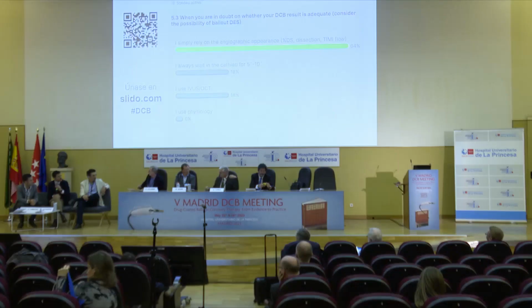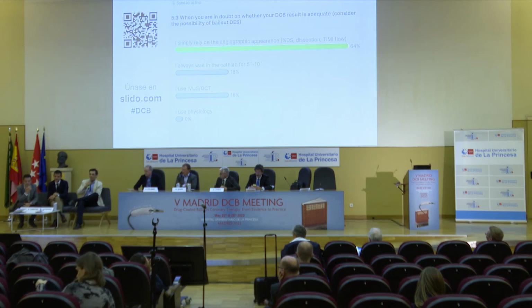Yeah. But the opinion of the experts? What do you think? What is your opinion, your practice? Well, I think that mainly I rely on the angiographic appearance in many cases, but if you are not sure, if you are thinking that perhaps there is a problem, you can use the OCT. But I think in the majority of the cases, with the angiography, you can take the decision. I think so. So in my case, probably it's a combination of both. To rely on the angiography, of course, you don't have major dissection, the diameter stenosis is acceptable, and then also it's important to wait for some time.